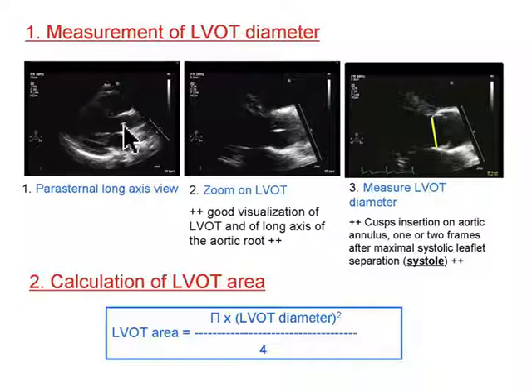And actually right now, I can tell that when the aortic valve leaflets come together, they have that little white line at the tip of my arrow. You can see that little white line. That's the leaflets that came together. That's during diastole, the heart's filling, those leaflets are together. Now, this is just a frozen and zoomed-in version of that exact same valve.